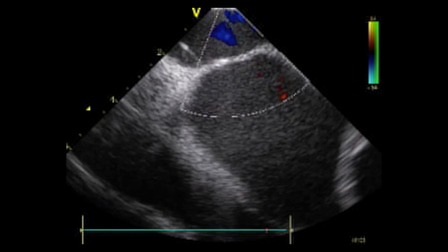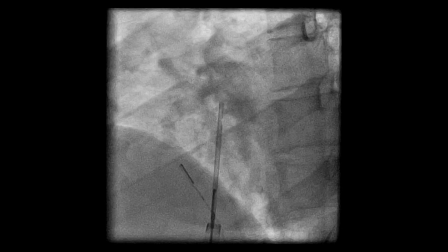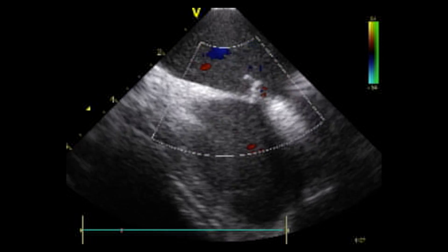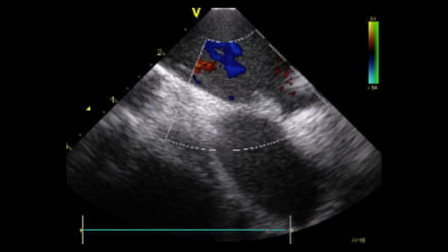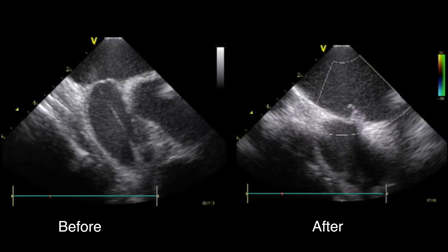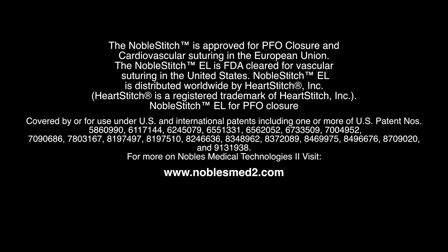The quick knot is now deployed, leaving only a polypropylene knot in the right atrium and nothing on the left side. This can now be confirmed through ultrasonic imaging that we have completely repaired the atrial septal aneurysm, closed the atrial septal defect, and closed the patent foramen ovale. This case demonstrates the ability of the Noble Stitch EL to effectively close PFOs and to suture other cardiovascular structures.